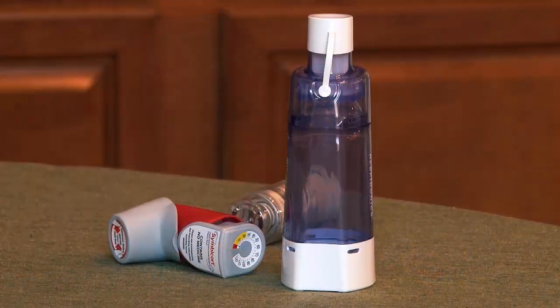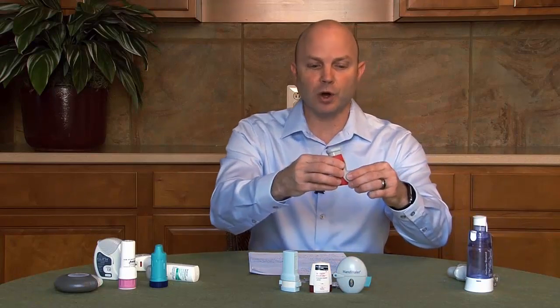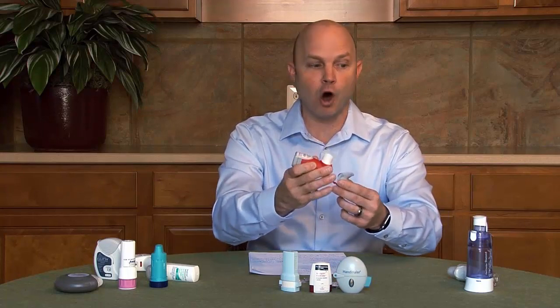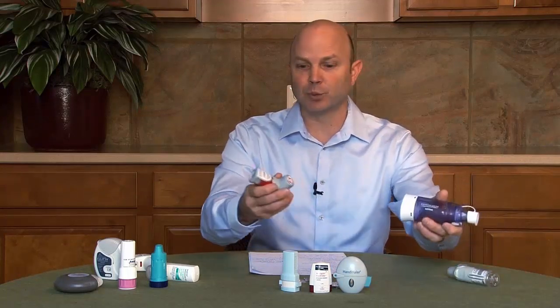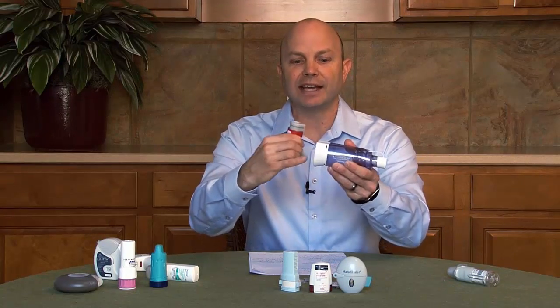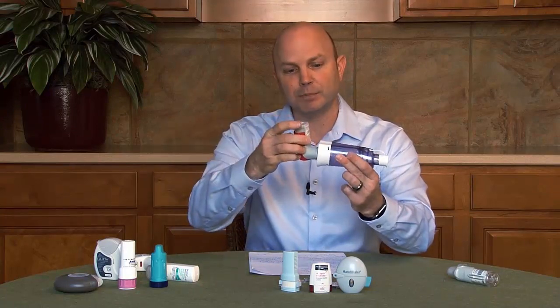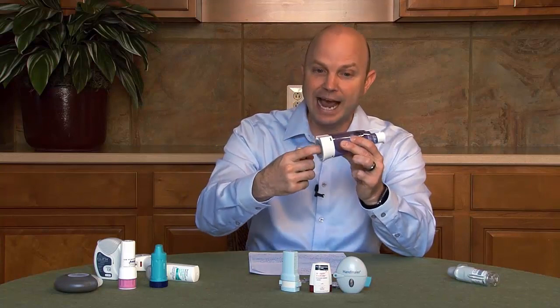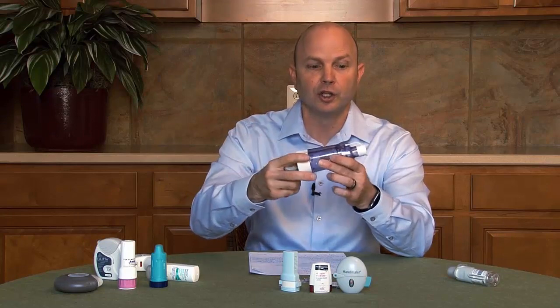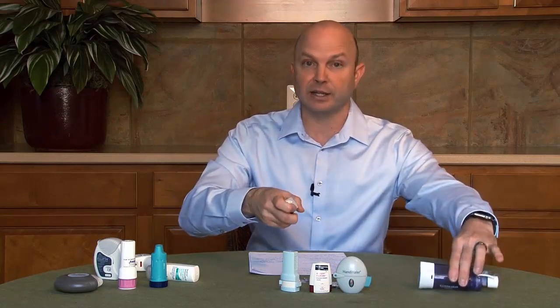This group of medications also needs to be primed the first time you use them. Most of these will also include a cap of some sort, and it's really important to make sure that the cap is off. I've also seen times where people insert an inhaler inside the spacer and the cap gets lodged inside. So each time you go to use this, you're putting the inhaler inside, you're recapping it, and you're actually not getting any of the medicine deposited into the lungs. So make sure that you use these properly and the caps are off when you're inhaling the medicine into your lungs.